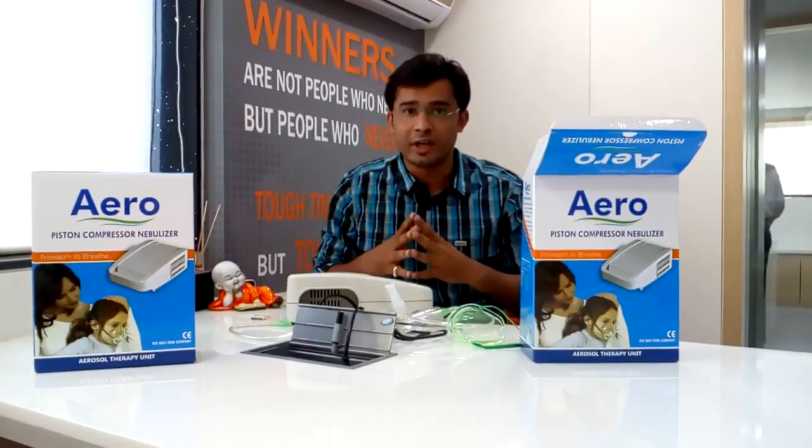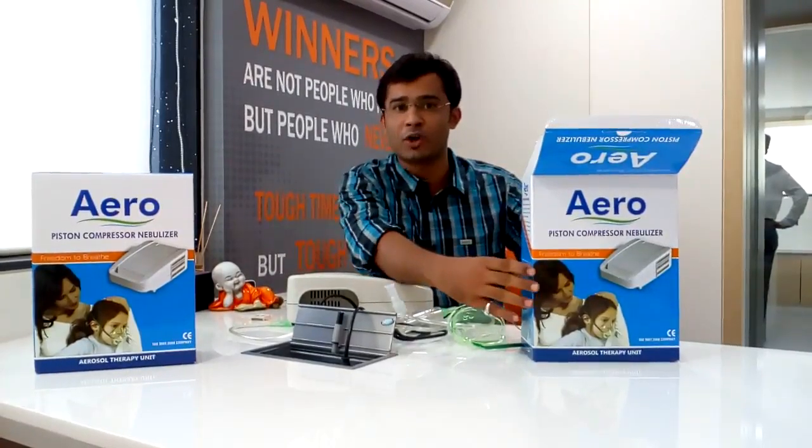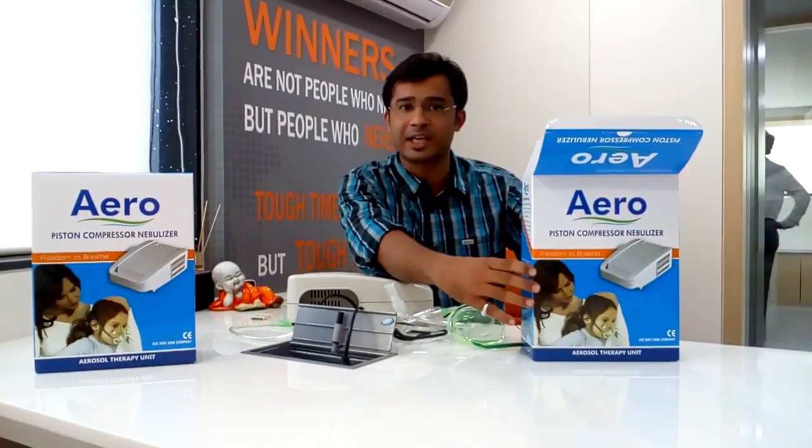So this was a nebulizer demonstration, manufactured by Heman Surgical Industries Limited. It is available on Flipkart, Amazon, and many other marketplaces.